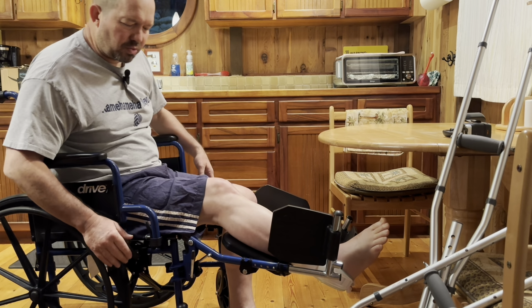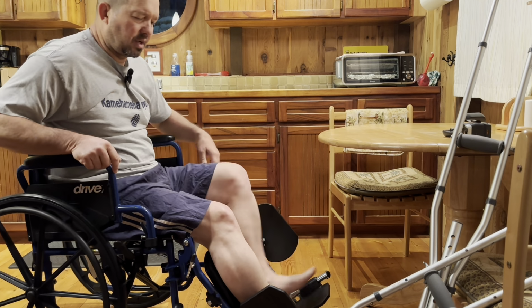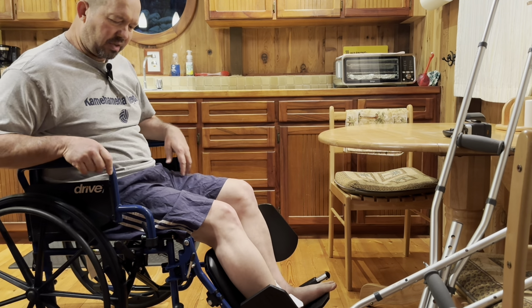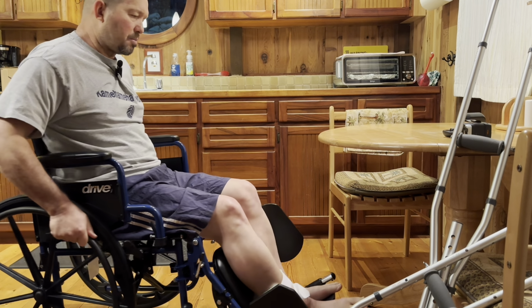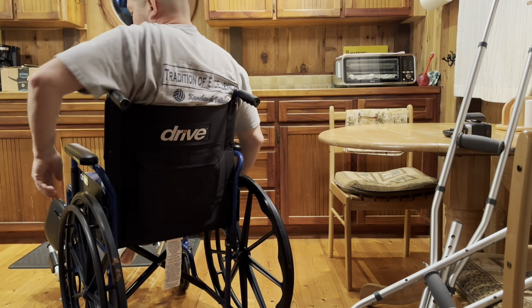Overall, the build quality is really good. I think everything is welded very well, and there's a lot of metal, a lot of plastic. Everything's very sturdy. In the back here, you can see there's a Velcro pouch. You could fit maybe a document manila folder.